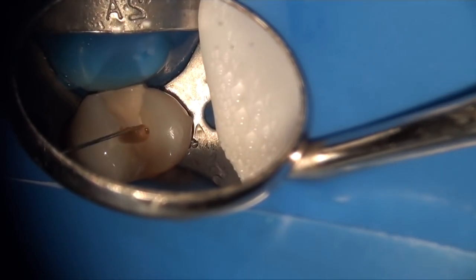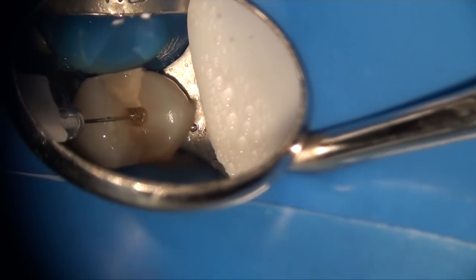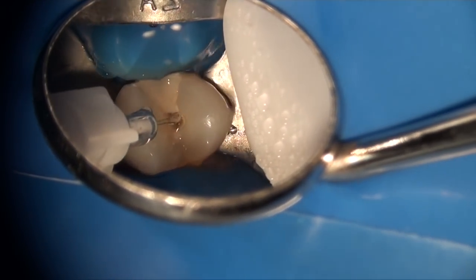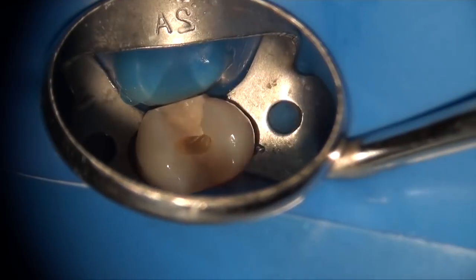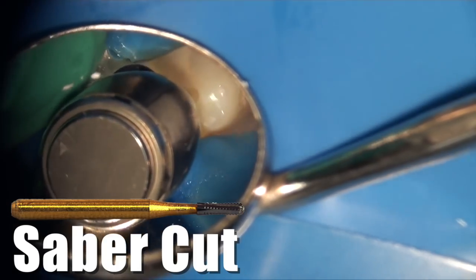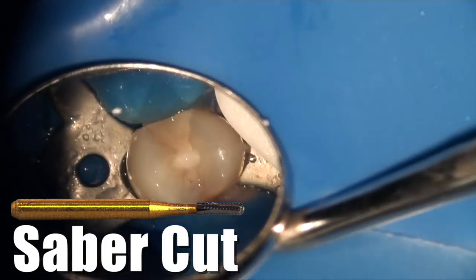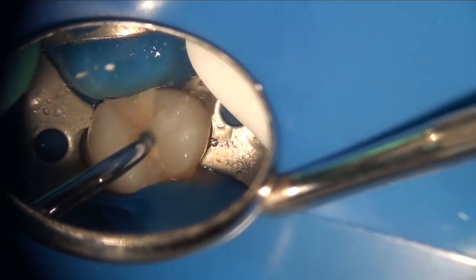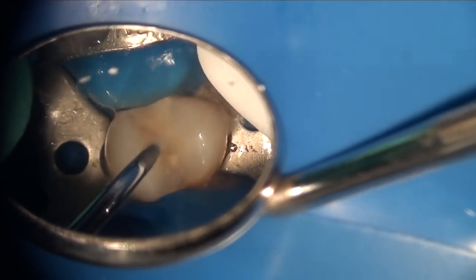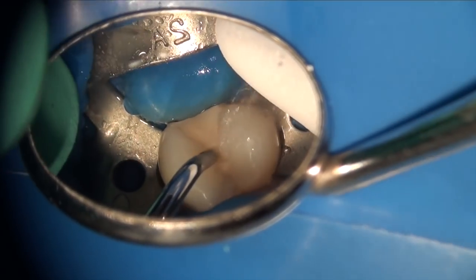The first goal anytime you're treating a tooth that has irreversible pulpitis is to nick the pulp. Although you always test the tooth and make sure it's already numb before you start, you always want to give an intrapulpal at the pulp horn in these cases. The patient never feels the intrapulpal, but what it does is act as assurance for the rest of the procedure. The goal is the patient should not feel the intrapulpal, but you have to have an intact roof of the pulp chamber for it to work.